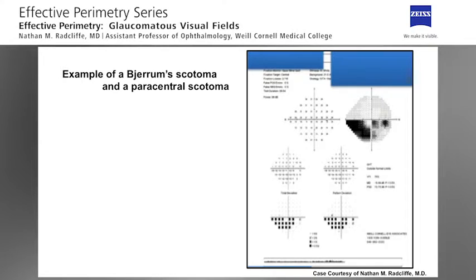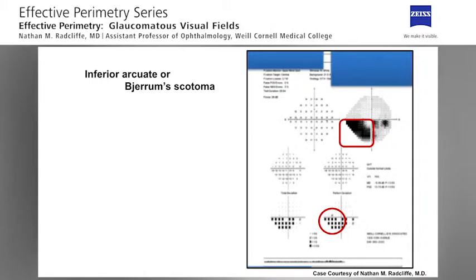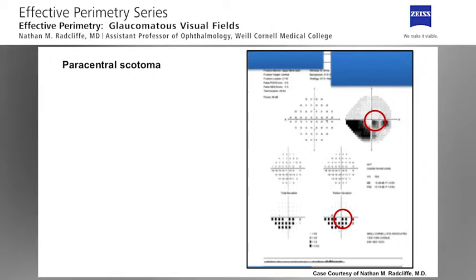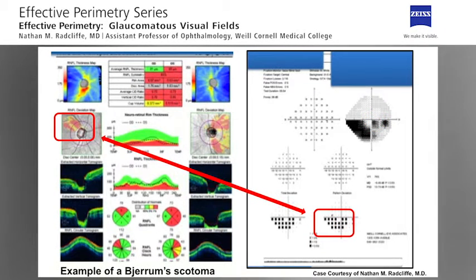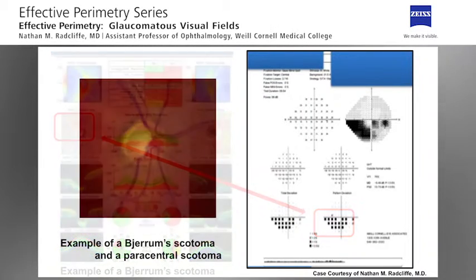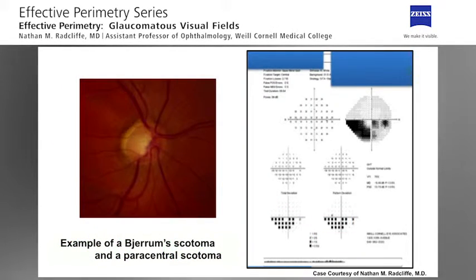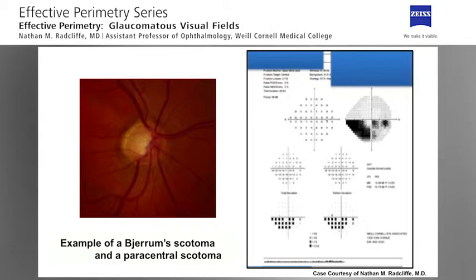This Humphrey visual field demonstrates two separate visual field defects. The first is a broad inferior arcuate or Bjerrum scotoma. The second is a smaller deep paracentral scotoma next to fixation. An examination of the Cirrus OCT demonstrates two superior retinal nerve fiber layer defects, each of which corresponds to the visual field defects. The optic nerve photograph demonstrates superior neuroretinal rim loss and two distinct retinal nerve fiber layer defects, again corresponding to the visual field loss.